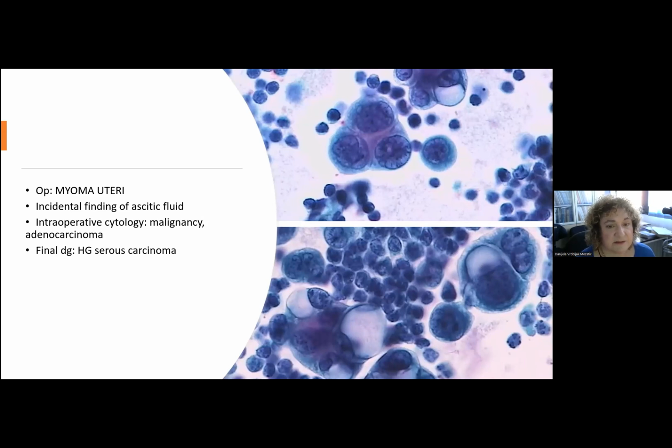They didn't suspect anything, and this was our intraoperative diagnosis, and of course they looked better and found some small tumors on the peritoneal surfaces, and it ended up as high-grade serous cancer. So it is really useful that we can report our finding intraoperatively.